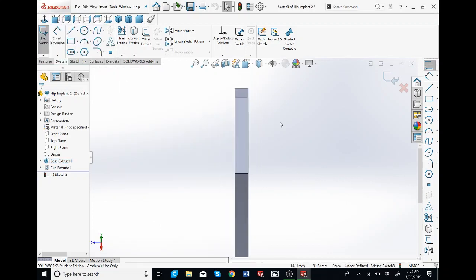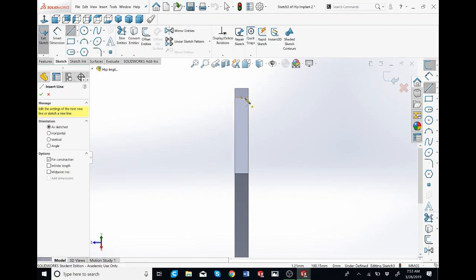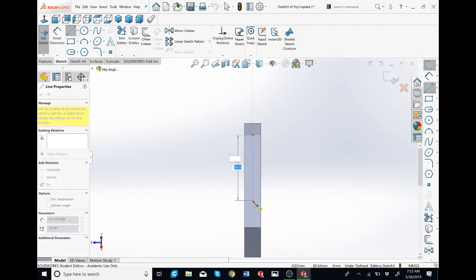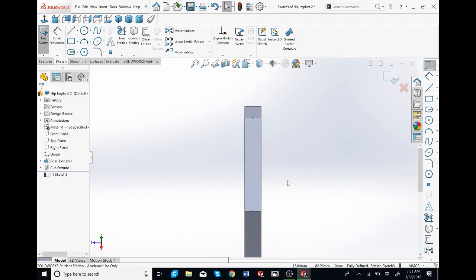So first thing we're going to do is draw a center line. I'm going to go over here, arrow, center line, and I'm just going to draw it from down. You'll see that the point pops up. I want it to be in the middle, so I'm going to put it over here, and then press escape. So now the line is connected to these two edges.